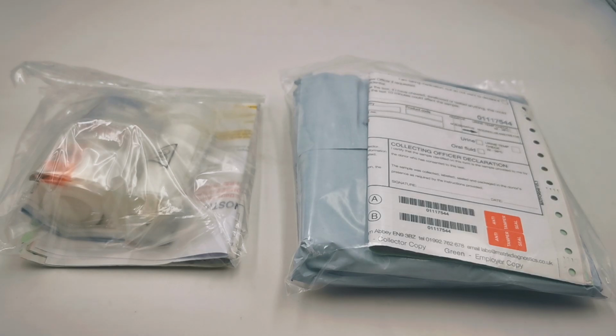The paperwork that accompanies both must be completed fully, and we're going to, in this guide, run you through the various elements which have to be completed, whether this is intended for screening in a workplace or in a personal or home setting. It is vital, if you are to get your result from the laboratory, that this paperwork is completed in the following manner. Otherwise, the sample will be rejected and you will have wasted the purchase price of the test kit.